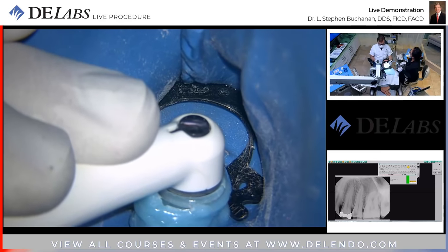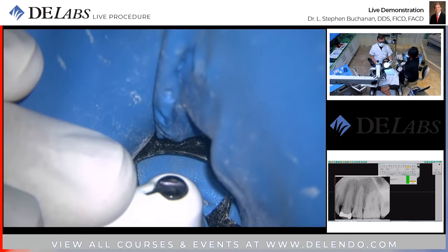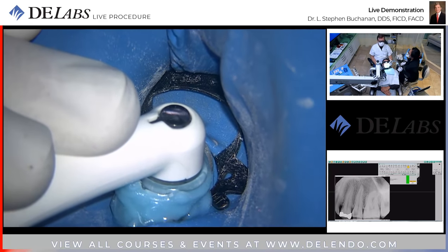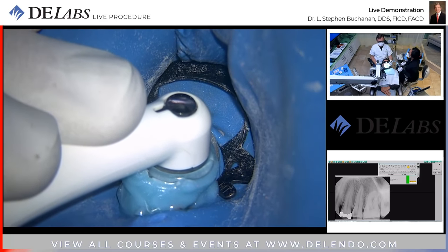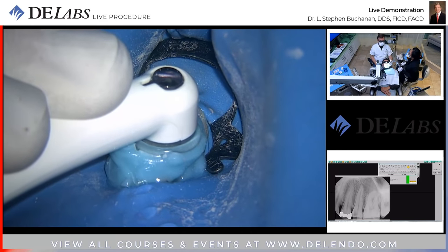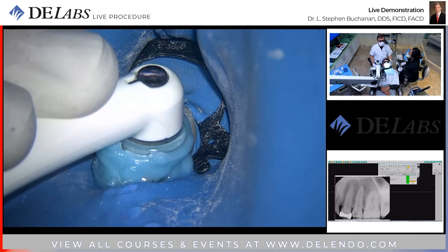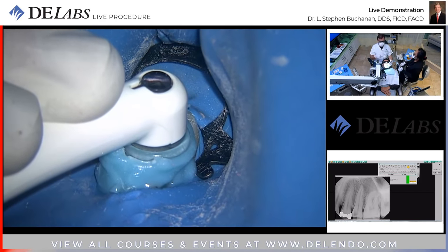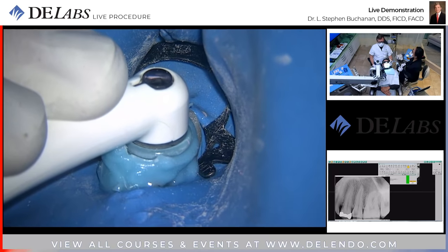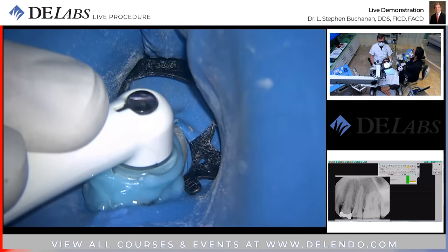So basically, the platform is a custom gasket for each tooth so that we have a seal inside the root canal system because we want to have a negative pressure environment there. That's created by the backwash of the fluids and the venturi effect created when that happens. The cleaning happens when the vibrating port that is redirecting the fluids back towards the handle to create this vacuum vibrates that little device, that little tube, and that is sending a sonic signal.